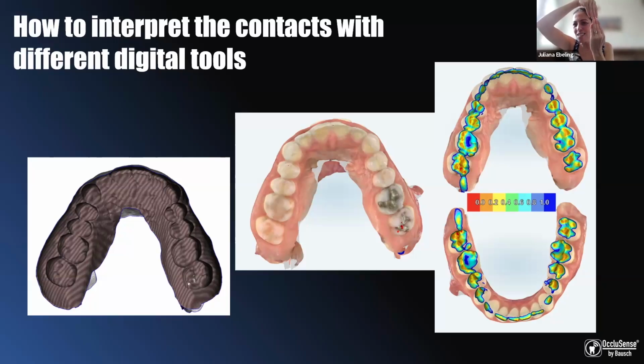I have only contact through these surfaces. So what we are seeing when I have a crossing of the meshes here is measuring the periodontal ligament movement. Okay? It's okay until here.